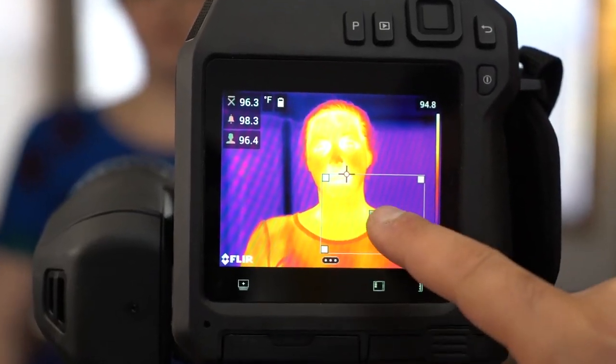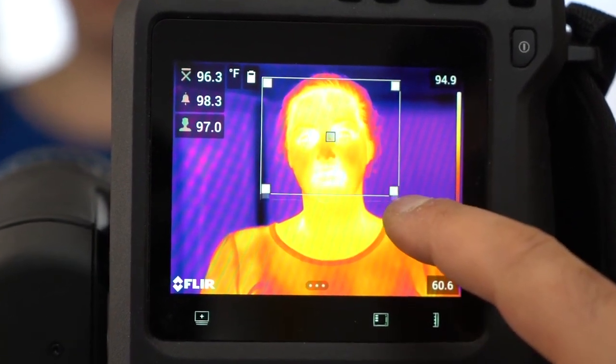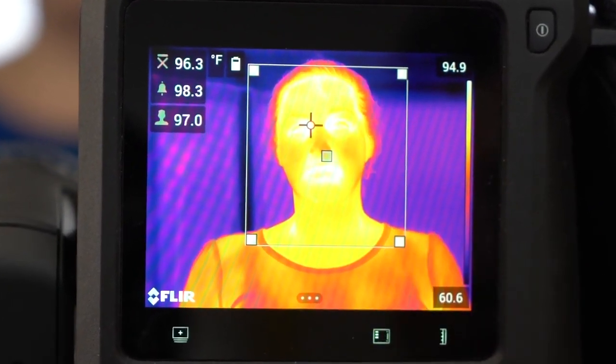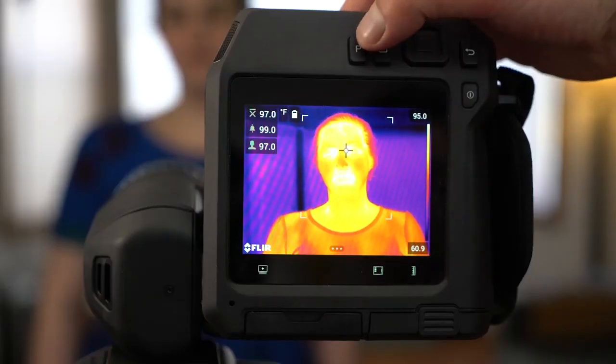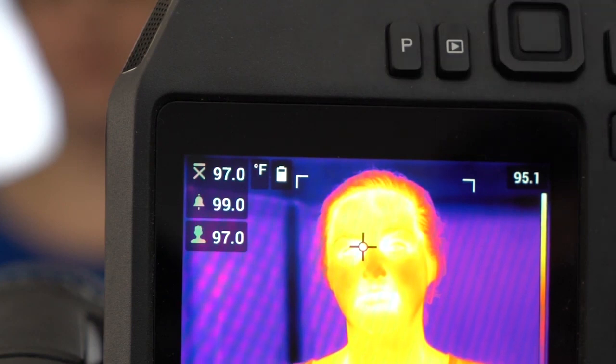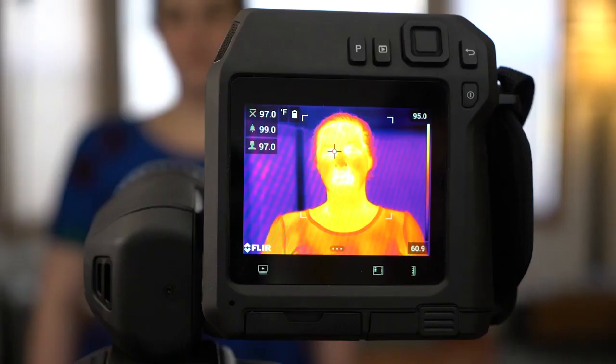We'll set our baseline using a person whose body temperature is within normal range and placing the area of interest over our subject. Press the P button to set the baseline. The camera has now been set to alert us when it detects a temperature over 2 degrees higher than the baseline.